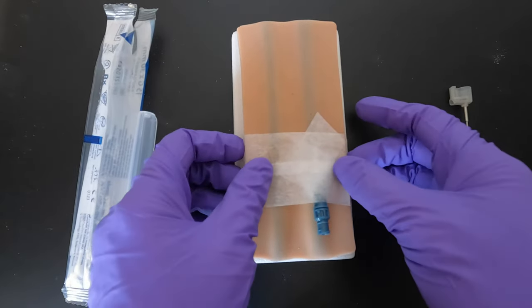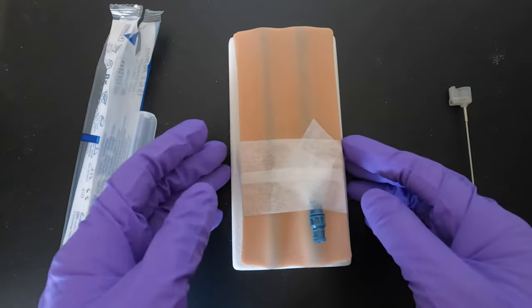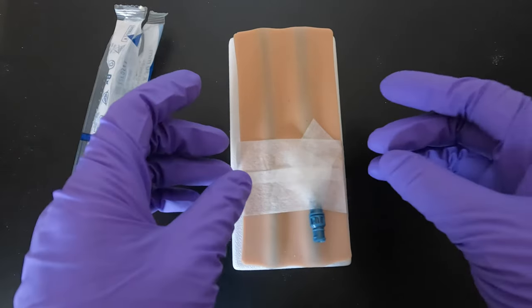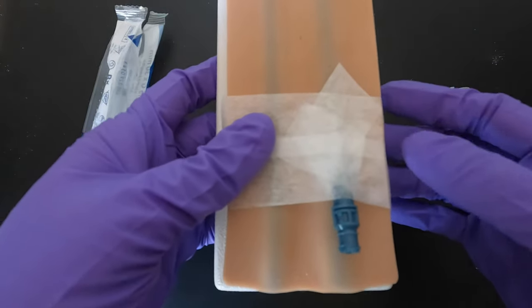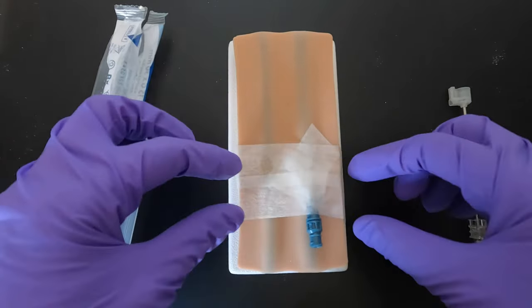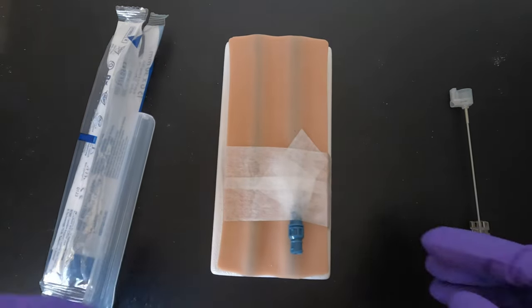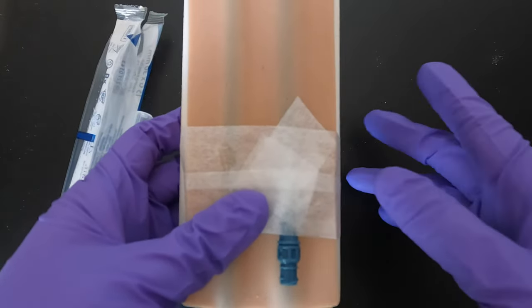In our unit, different people have different styles and techniques, and I haven't seen any patients pull out their needles because of the taping — it's secured. Some nurses tape the top first, then the crisscross, then one on top — it doesn't matter, as long as you've secured it properly.